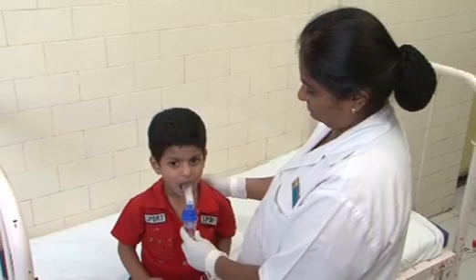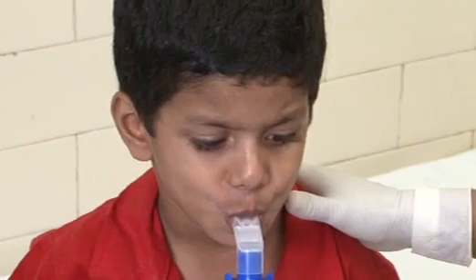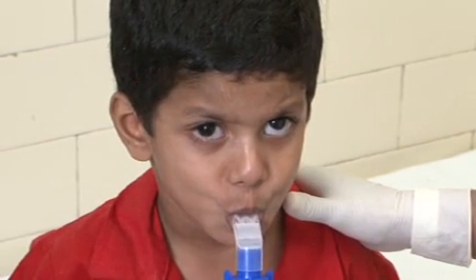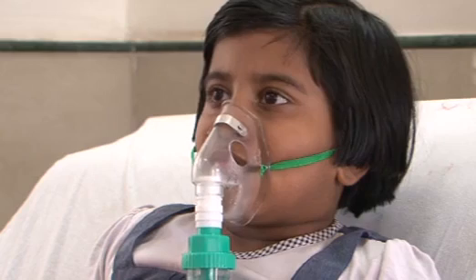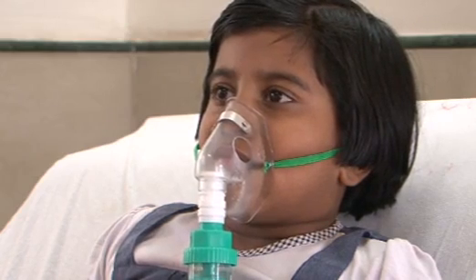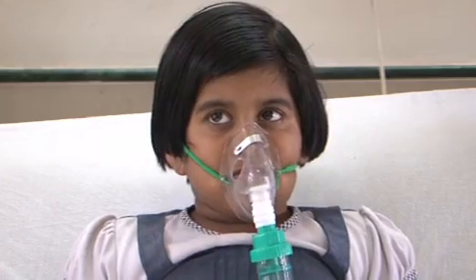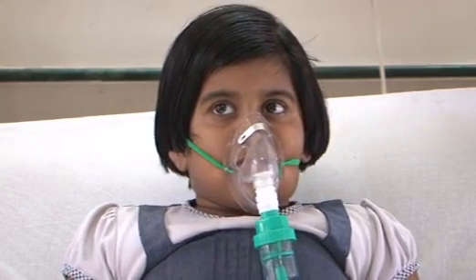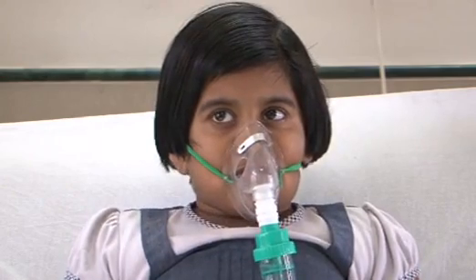In older children, ask the patient to keep the mouthpiece inside the mouth and close the lips around it. Ask the older children to take slow, deep breaths and, if possible, to hold the breath for up to 10 seconds before exhaling.